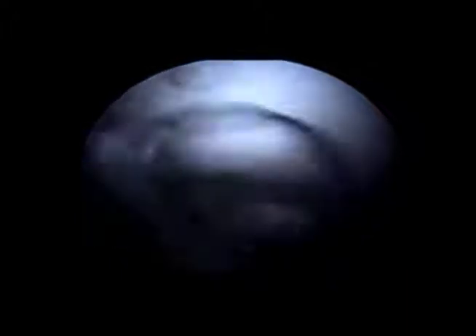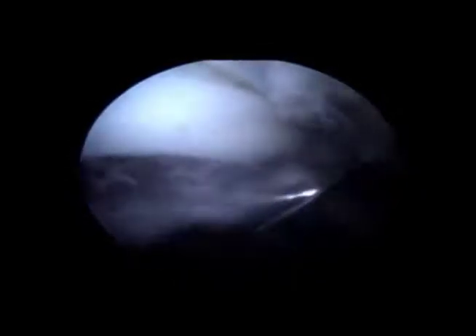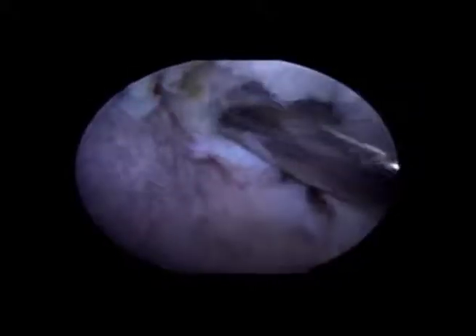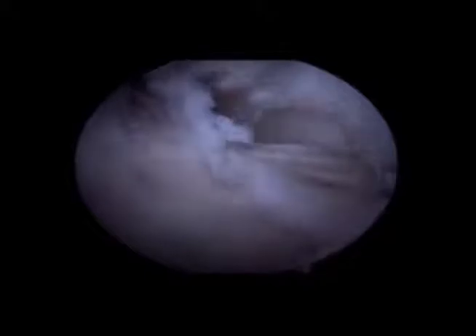Traction is released and the peripheral compartment is assessed in order to evaluate the femoral cam lesion. A large femoral lesion is seen here, now viewing from the mid-anterior portal and working through the anterior lateral portal. The femoral osteoplasty is performed with a motorized 5.5 mm burr. The lesion is addressed from the medial to lateral synovial folds with careful attention paid to avoid the vessels. Dynamic evaluation subsequently shows appropriate cam resection and resolution of the area of conflict.